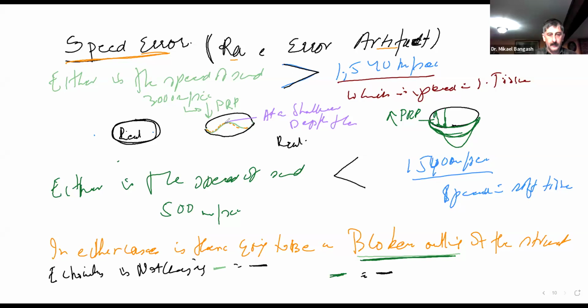The boundary appears to be at a shallower depth than the actual boundary because of a faster propagation speed, or vice versa, where the boundary shows to be at a greater depth mainly because of a lower propagation speed.